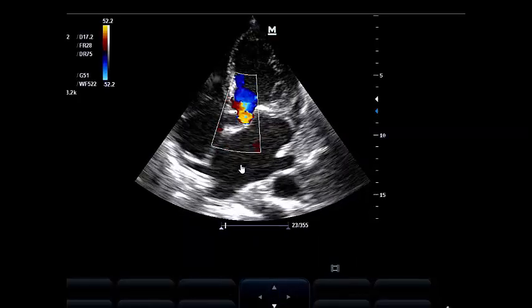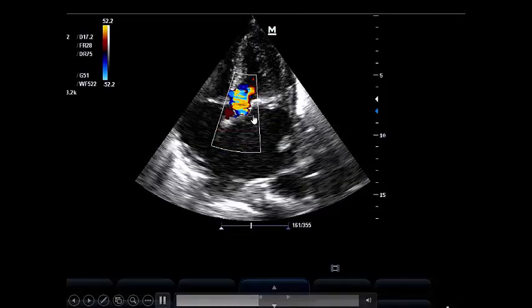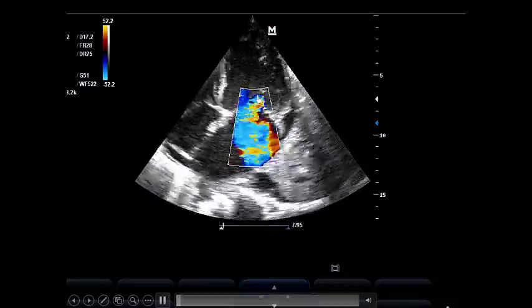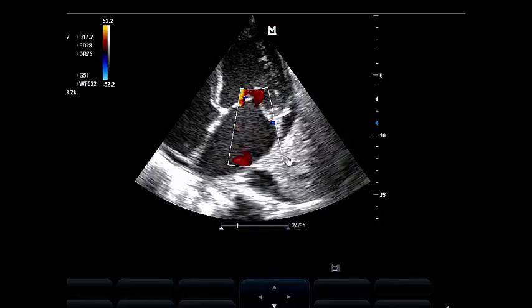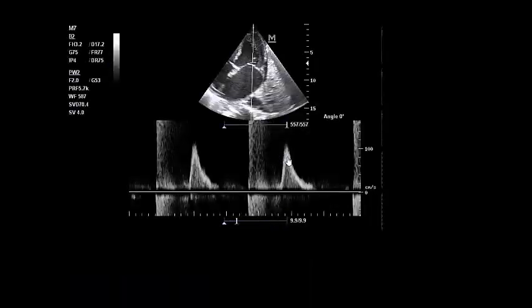You see here aortic regurg, moderate aortic regurg, moderate mitral regurg. So, in the presence of moderate aortic regurg and mitral regurg, I will consider this ejection fraction too poor for a regurg lesion. Here, restrictive pattern of the diastolic dysfunction denoting congestion, going with cardiogenic pulmonary edema. This is a very tall E wave compared to the A wave.